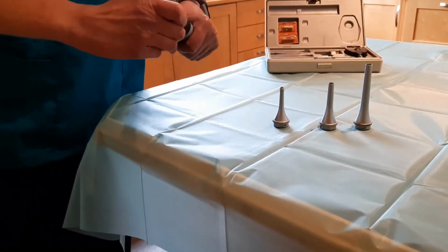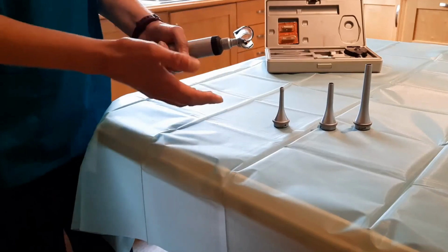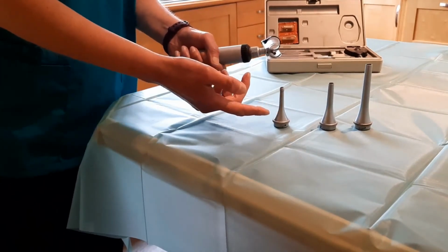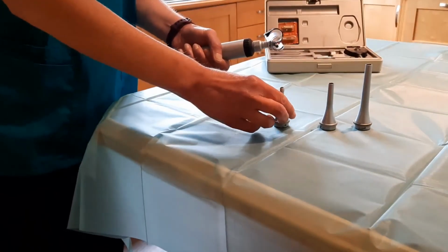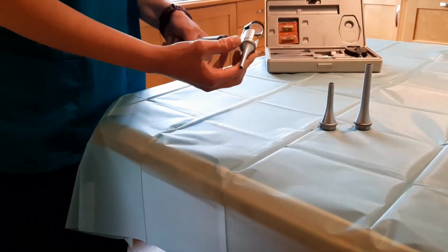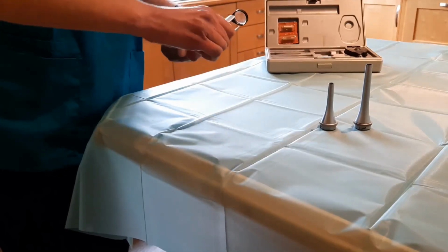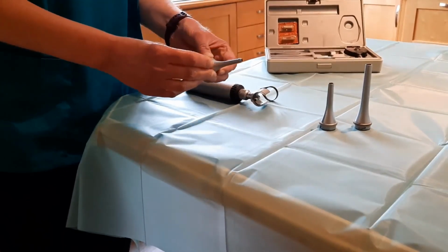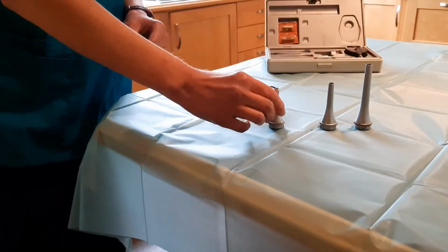This fits into the neck of the power base, and depending on the animal, we'll select one of these specula. So for example, for a cat, and then maybe for progressively larger dogs with longer, deeper ears. These just slide into place and twist to hold securely. It's important that these specula are made of stainless steel or plastic so that they can be easily cleaned and disinfected before and after use.